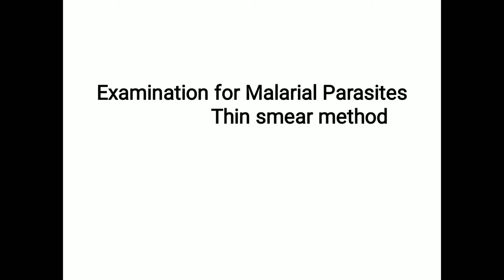We will now discuss how to collect the blood for detection of the malarial parasite. For demonstration of malarial parasites, blood should be collected not during the peak of fever, but optimally several hours after the fever. Bouts of fever follow the synchronous rupture of a large number of parasitized erythrocytes, releasing membrane shreds and contents.